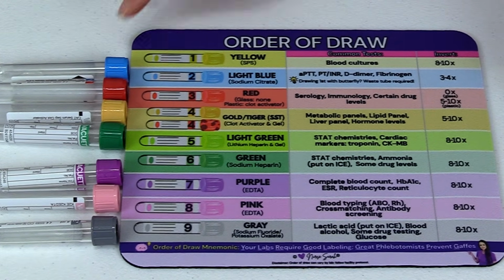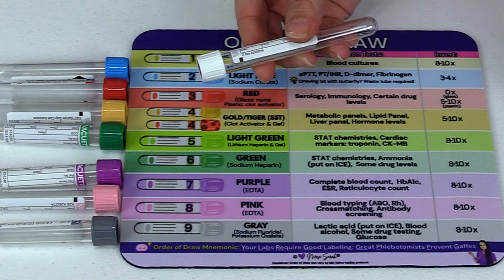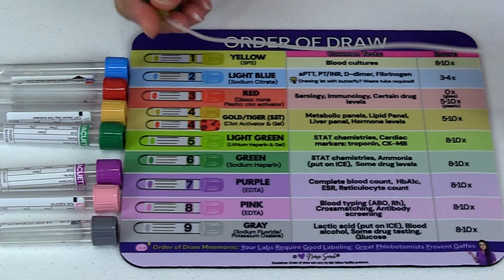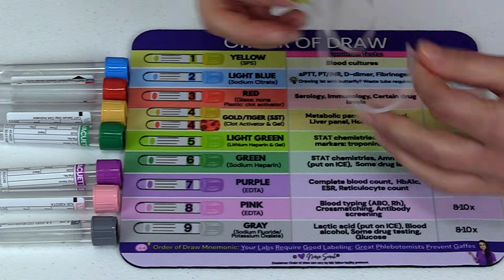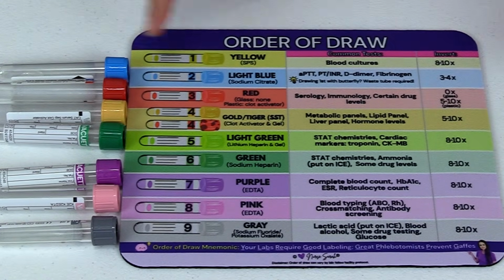So let's say that's part of your first draw, that's the first thing you're going to draw, or that's the only thing you're going to draw. You have to have a waste tube, and that was that tube that I went over earlier. It has no additive in it. Because if you take a peek at our tubing, that's a lot of air in that tubing. And remember I said that this tube is a special tube. It has to have a specific blood to additive ratio. So we have to clear this air from this tube into our waste tube, and then we can pop that tube on.